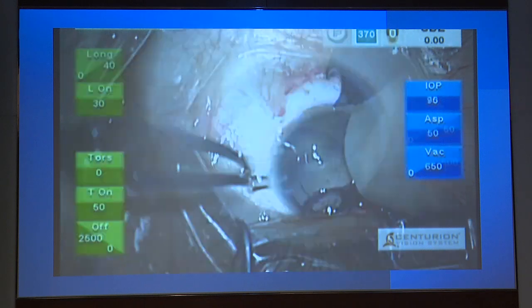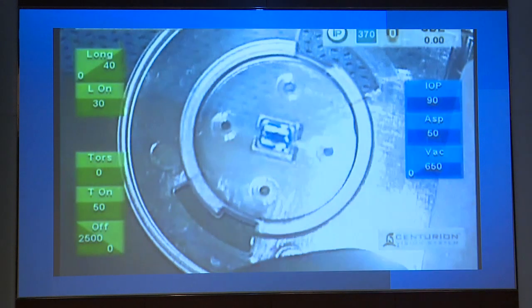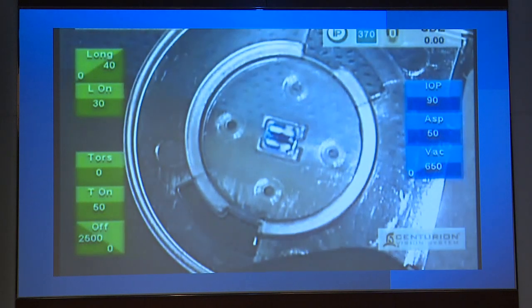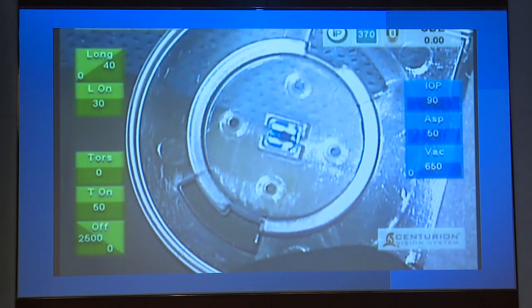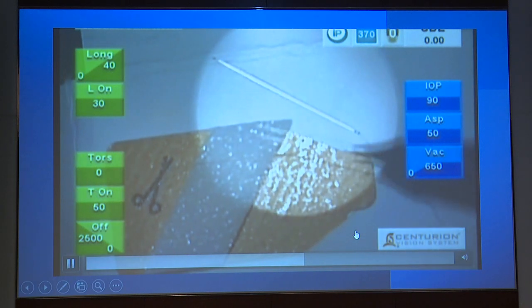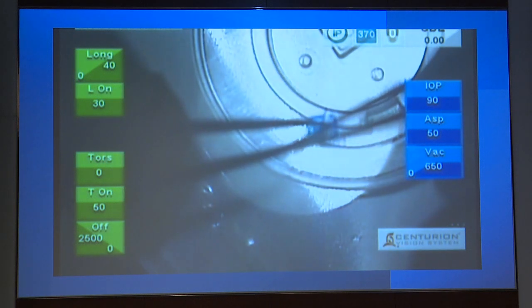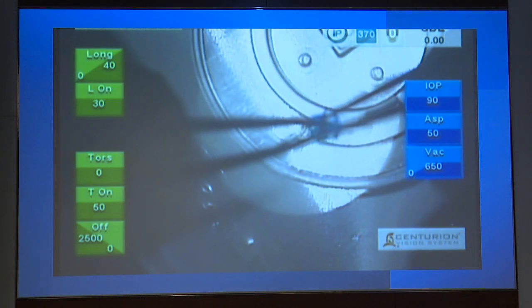So let's mark 3 mm from the limbus. Now we are stuck with this, and let's look at the anchor, a device fashioned after a boat hook with 2 limbs. We retrieve a double-armed prolene from supplies and thread one end of the needle through the suturing hole of the anchor and then tie it tight.